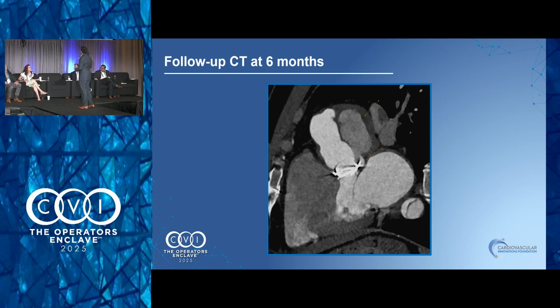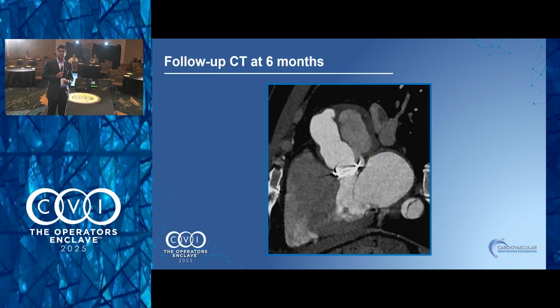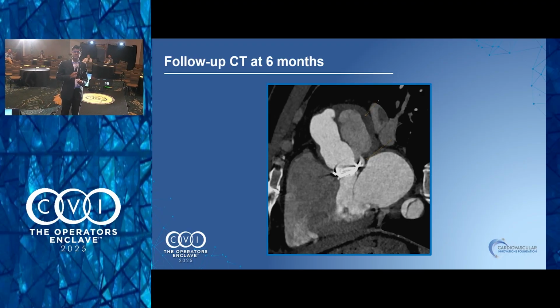Sorry, yeah. So basically, this is the mechanical valve, aorta, and then the big sac on the delayed phase contrast CT. I had my best radiologist, Dr. Carr, who helps us a lot, do this as well. We saw the contrast is the same, and then it's delayed phase here. So we know something goes from somewhere here, then fills up. Obviously it's a concern because the sac is pretty big, and he's 49. How long ago was the surgery? 6 months ago, the type A, and it's a Bentall.